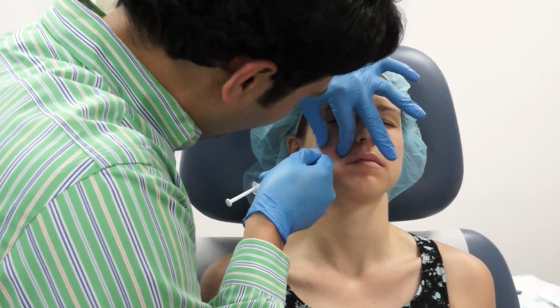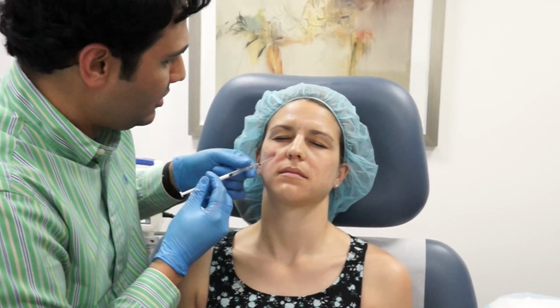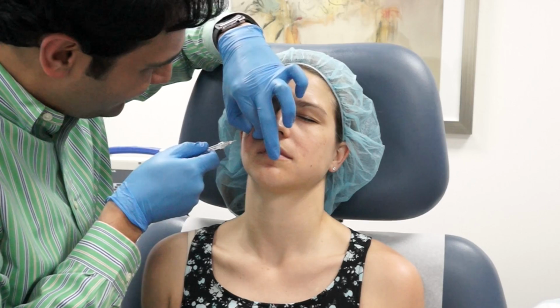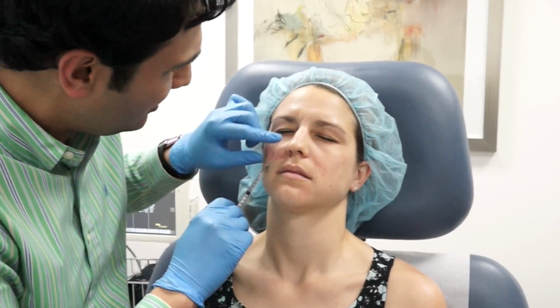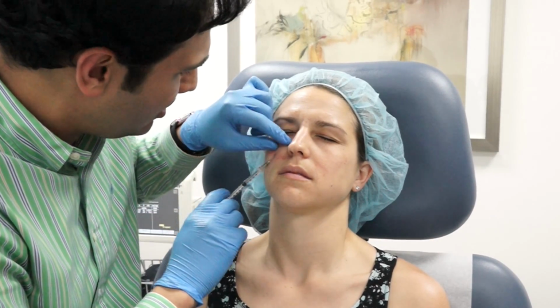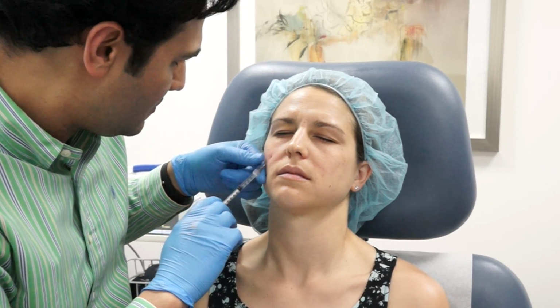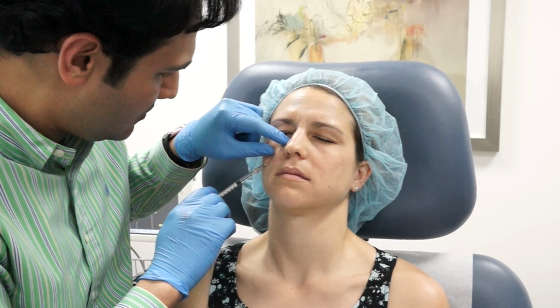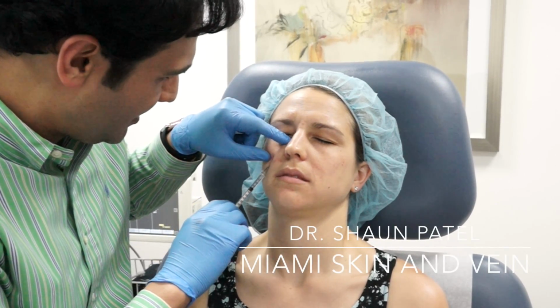So the first thing I'm going to do is lift up the soft tissue that I want to get under for the injection, and I'm lifting up the soft tissue, as you can see, and I'm introducing the cannula. I'm going to deposit the filler in the supraperiosteal plane. This is right on top of the bone, and also carry the cannula all the way up to the tear trough. In this case, we're using approximately 0.5 cc's of Juvederm Voluma, which in this case was mixed with saline. Filler placement in the anterior cheek and tear trough can really re-inflate a patient's face.